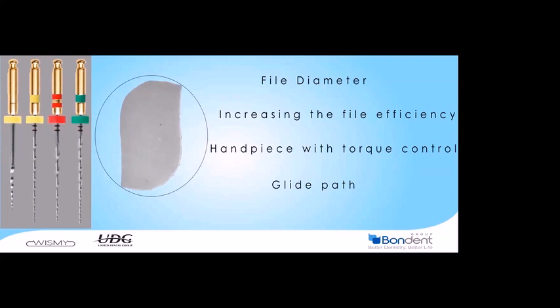The second one is a file whose size is 20 at the tip with a taper of 4.